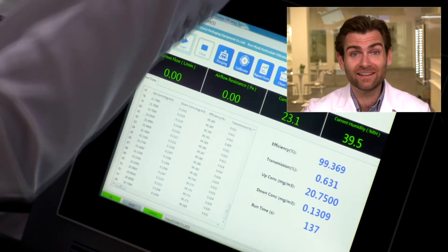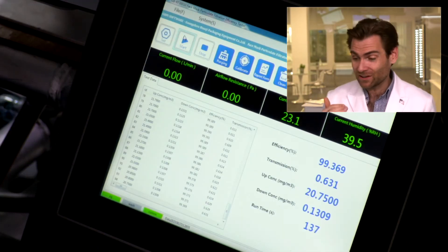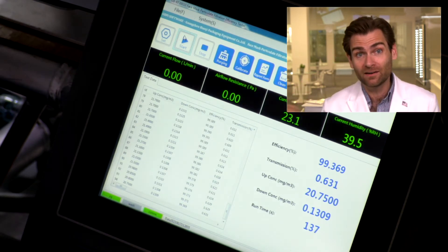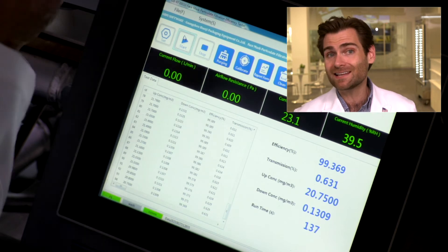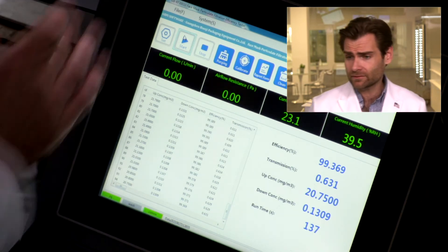Alright, let's check the filtration result. Their fold respirator did a couple of percentage points better, but remember N95 means 95% or better. This cup respirator is knocking it out of the park: 99.369%. That is an absolute great mask.